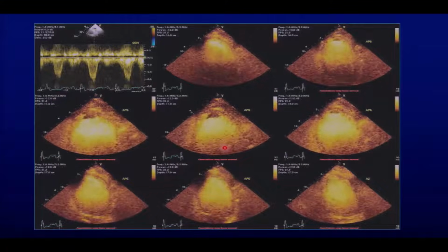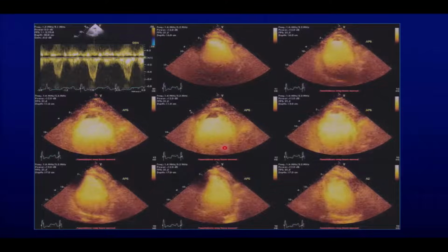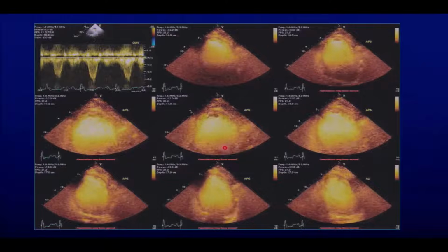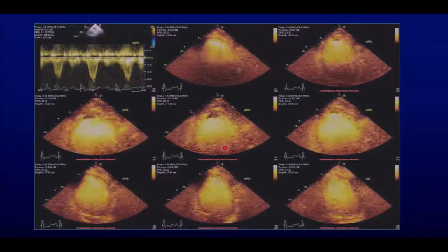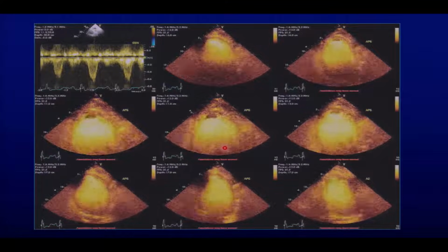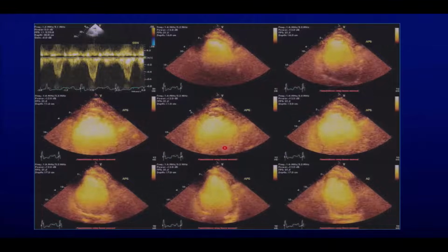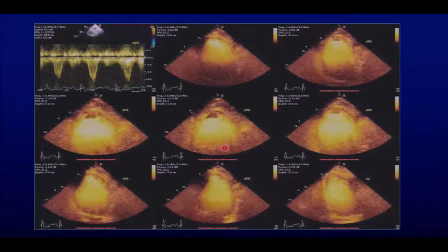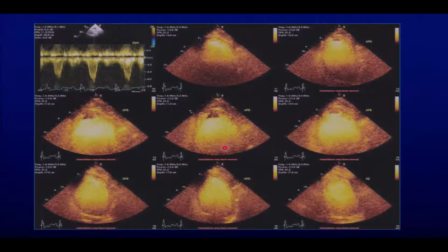And whenever you have such, then the area that you need to interrogate is very large. So if I'm concentrating on a plane or just a couple of planes, I may miss the apex itself. So you want to make sure that you scan in different directions, that you cover all the area of interest or in jeopardy. Okay?